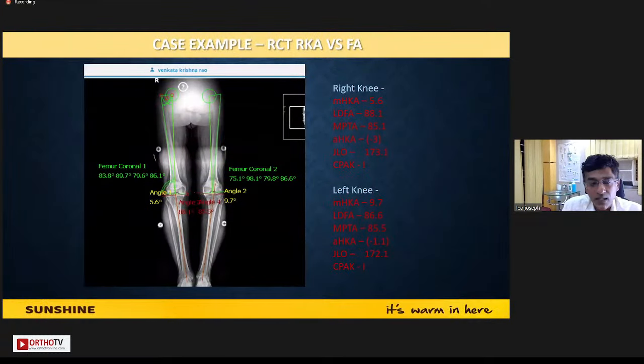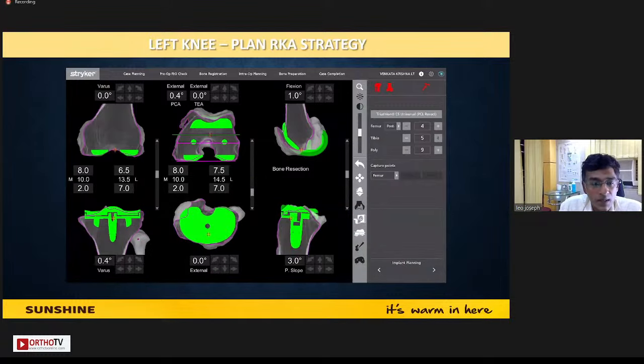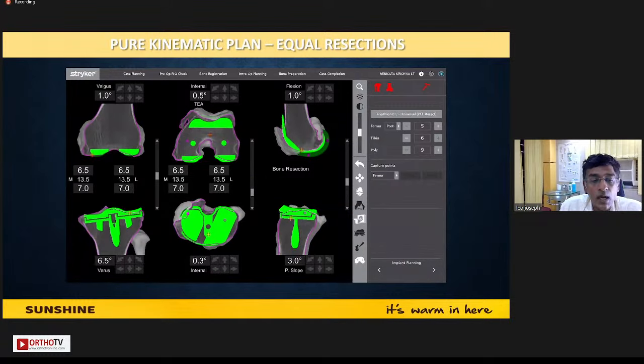So let us look at this example. For instance, the knee on the left has a mechanical alignment of 9.7 degrees in varus. However, when we do the measurements, the arithmetic hip knee angle is minus 1.1, which is probably what you're aiming for. Now, in this particular case, if we were to plan for an unrestricted kinematic philosophy, this would probably be what we would be doing. I should thank Suhas from Sunshine for giving me these slides. He's been kind enough to share them with me.